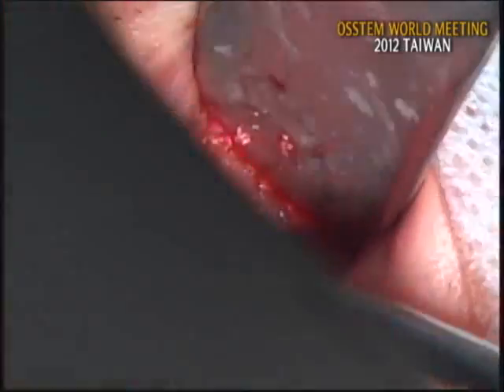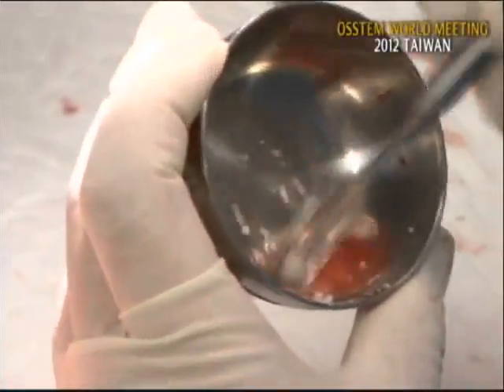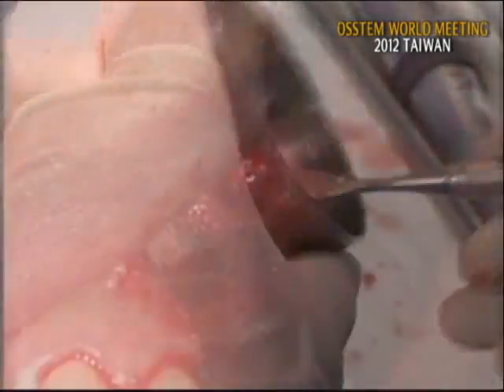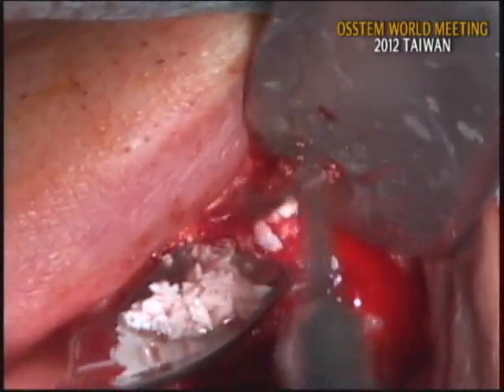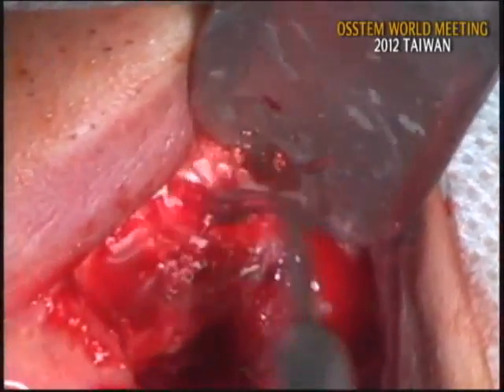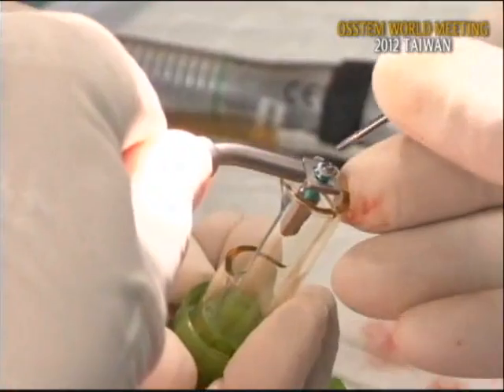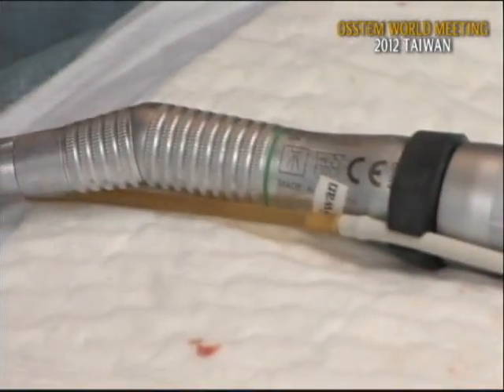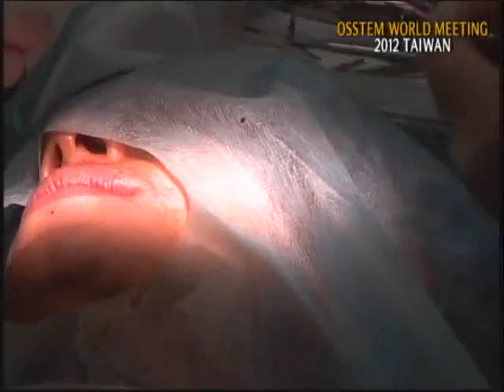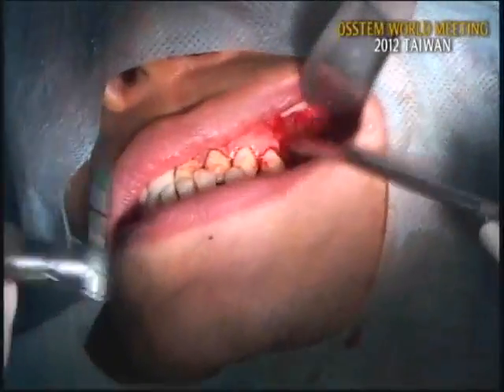Almost. Let's make a little more graft. Almost. Okay. And almost finished. Right hand. I think it's enough. It's enough, so I will place 2 implants with open wrench connection and disconnect, and again lightly close. Okay. Let's place. This is TS3SA 4.0 by 10 millimeter. Open, please.